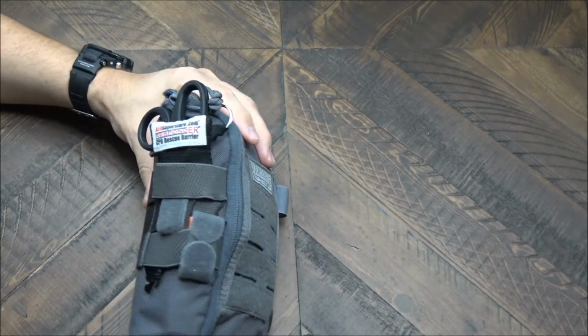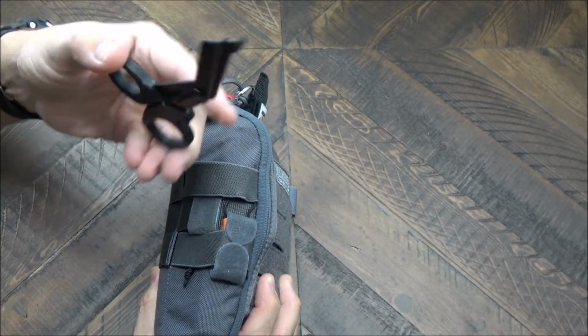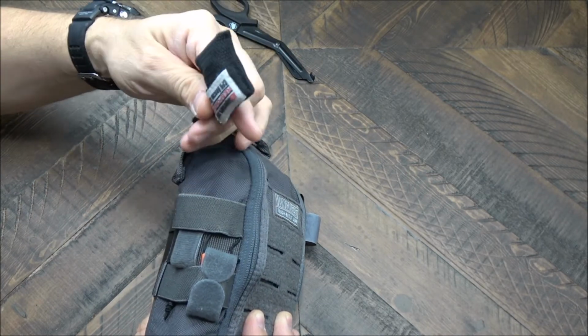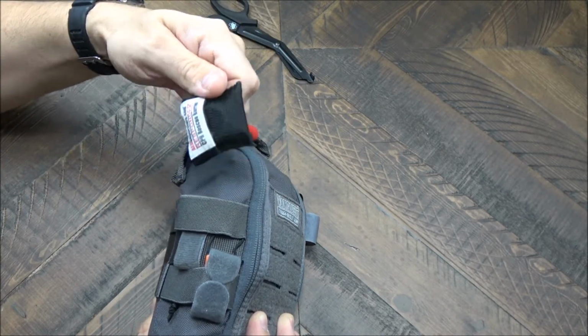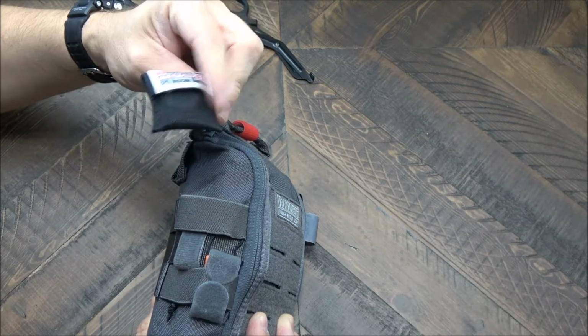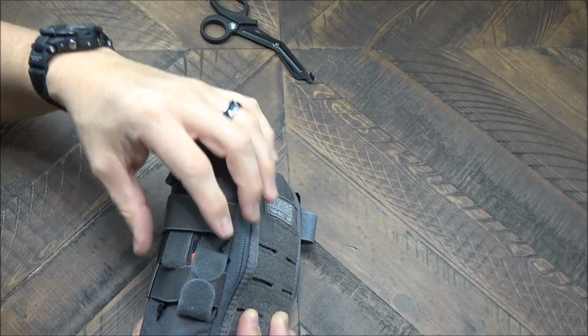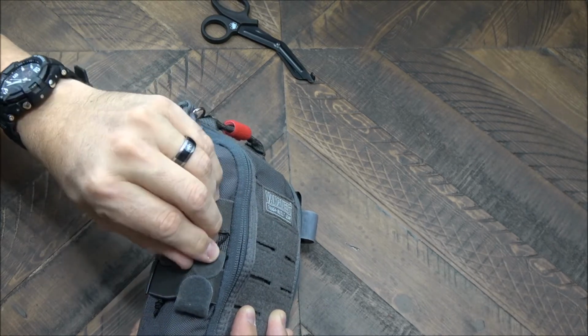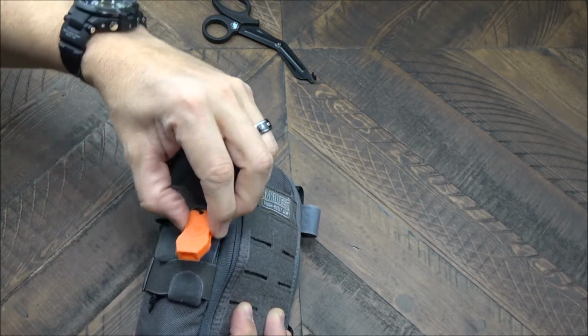Going to the other side, I've got a small pair of North American Rescue trauma shears. I've got a CPR face shield, which is critical. If you're doing CPR on somebody that you have no idea about their medical history, this is absolutely important. This thing comes with little gear keepers, and what I've got behind here is a whistle.